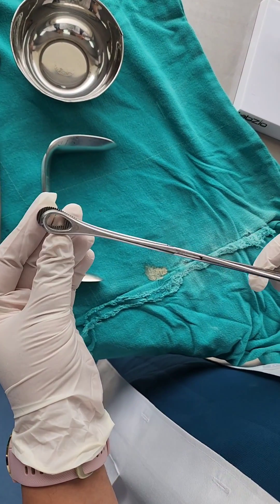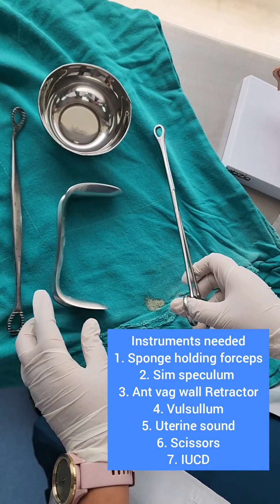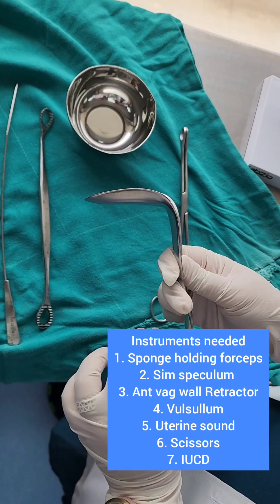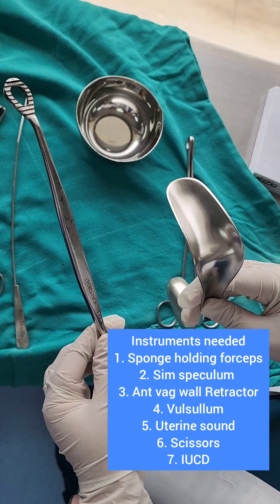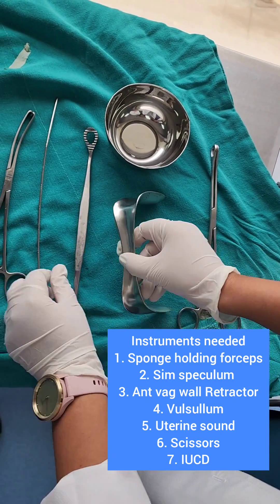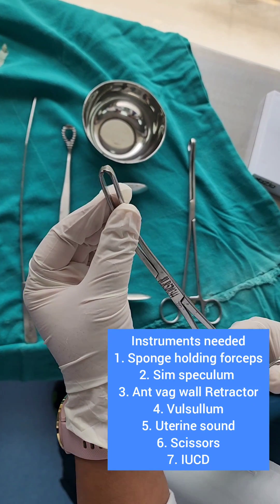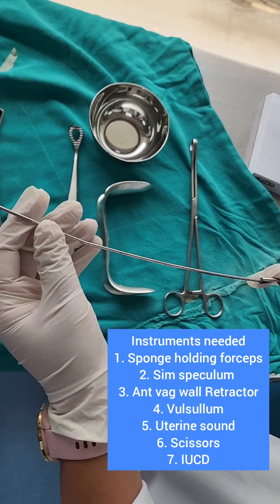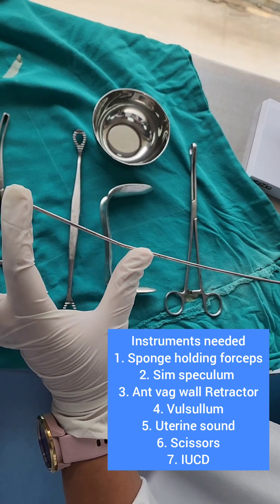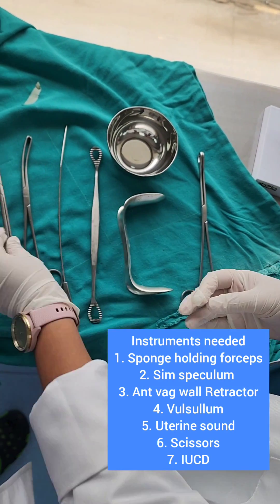We first need a ring forceps or a sponge holding forceps to clean the area. Then we use a Sims speculum — a Cusco's can also be used, but preferably a Sims speculum along with an anterior vaginal wall retractor. We need something to hold the cervix: a Valsellum or a tenaculum. We use a uterine sound to measure the length of the utero-cervical canal, and we need scissors to cut the thread of the copper T.